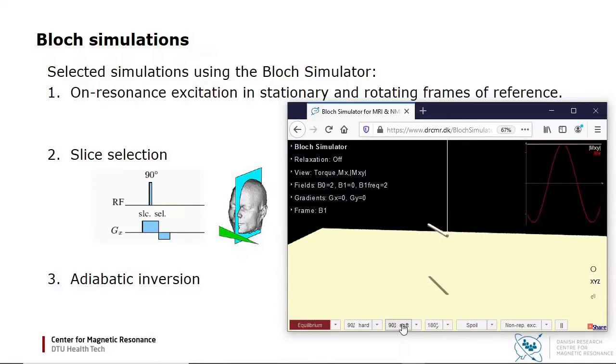If I apply another 90 degree pulse, I can rotate the magnetization further, for example to invert it.